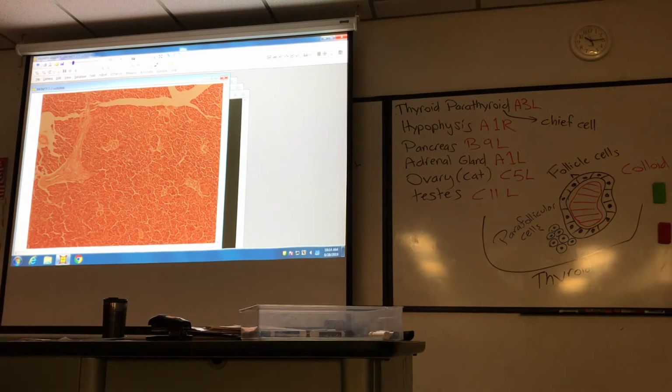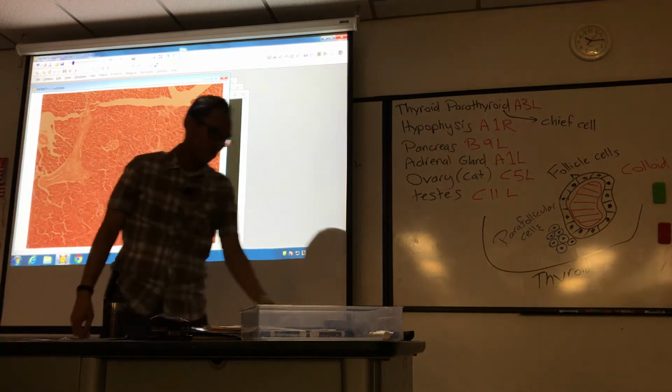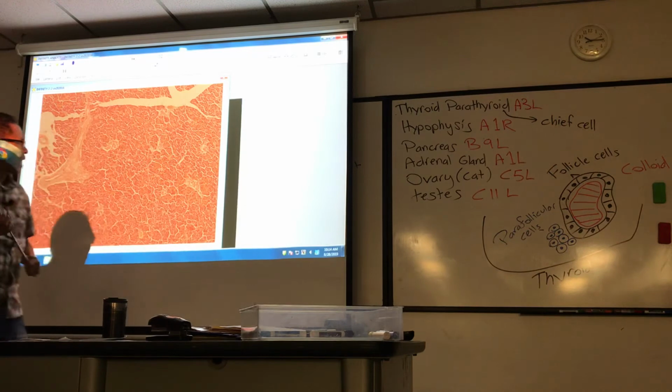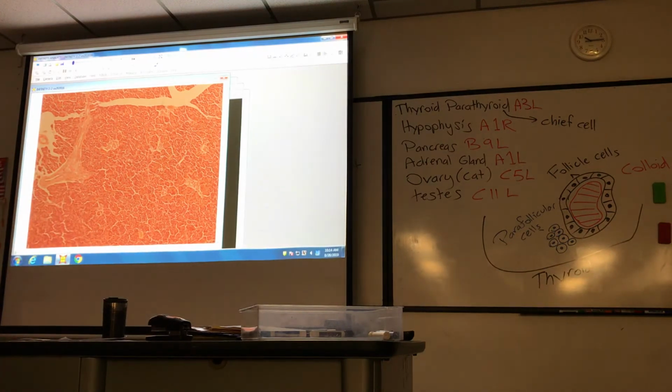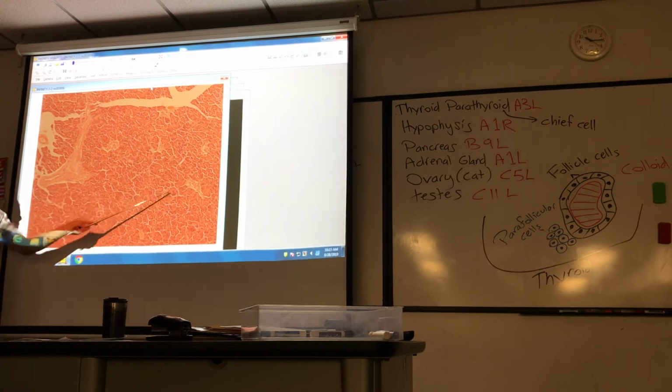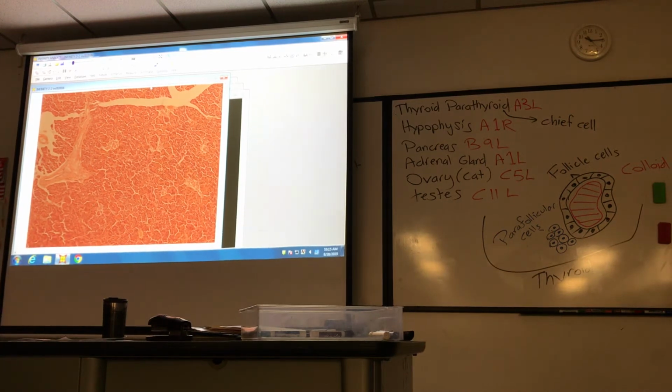So most of the pancreas is for exocrine function, for digestion. But for the endocrine function, the cells are very clumped together in little islands to regulate blood sugar. They'll secrete insulin and glucagon. They're called pancreatic islets. I'm doing it for you today, but Friday's lab you're going to show me stuff on these same slides. And see these little clusters of cells there, or there, or there? Those are the islets, okay?